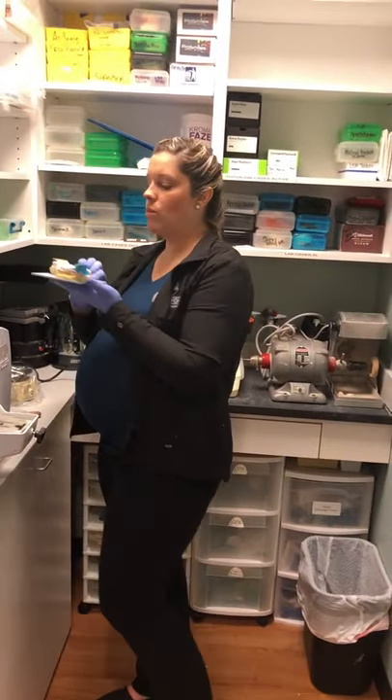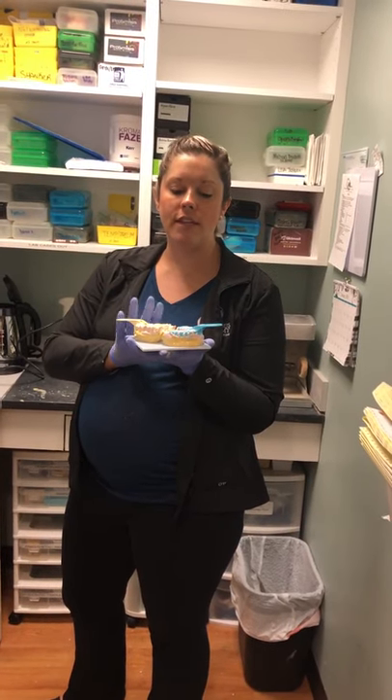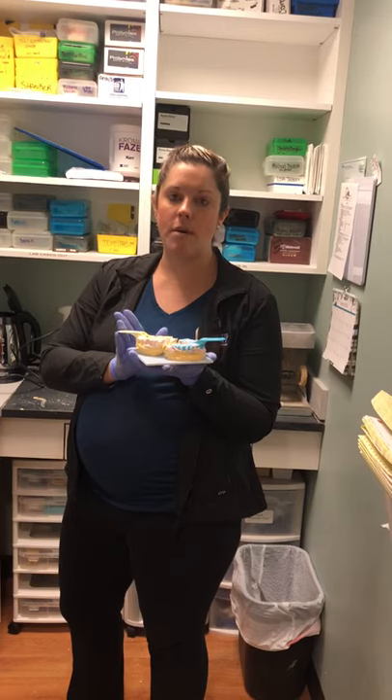Next, we're going to wait about 30 minutes, give or take, for these to dry. Once they dry, we're going to separate them from our trays.